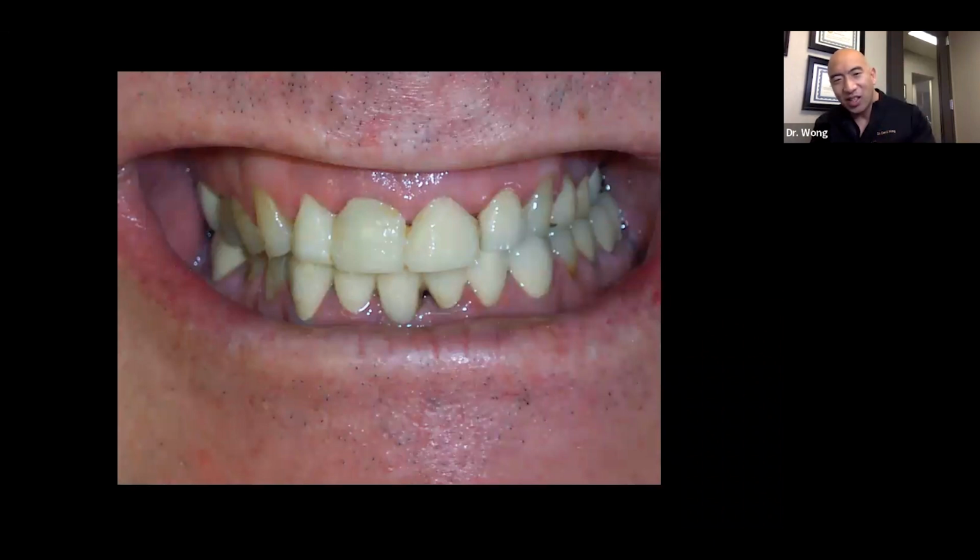By the time he comes back in 2 weeks, you'll see how that tissue is molding perfectly around that pontic area. And the tissue is nice and healthy. And we've got preservation of the ridge dimensions, which is the intent of socket grafting.